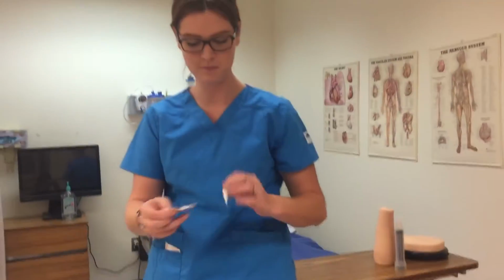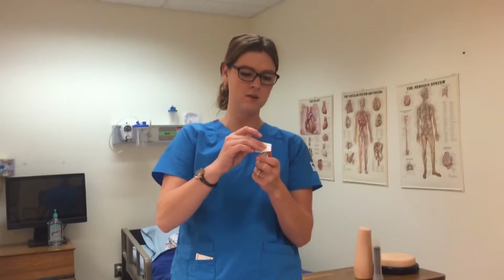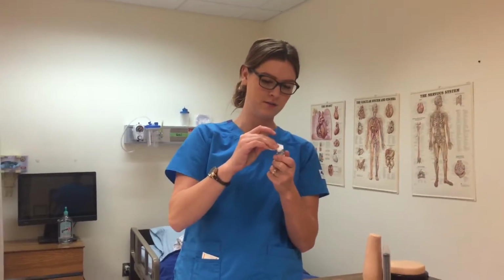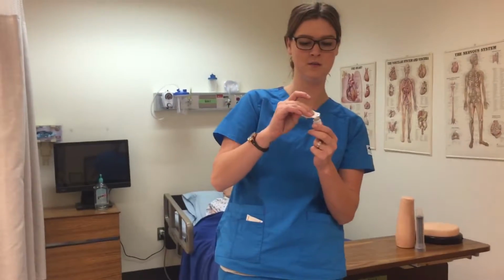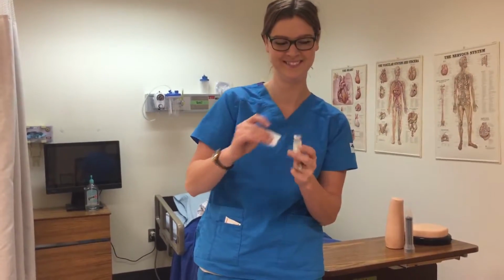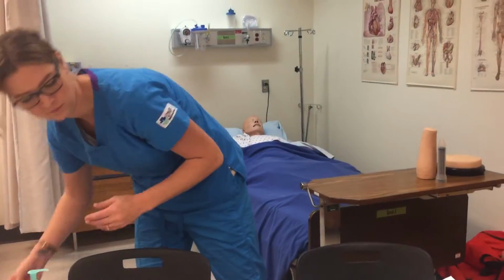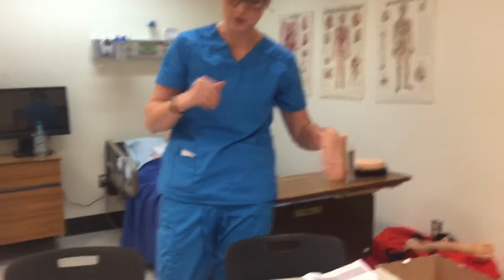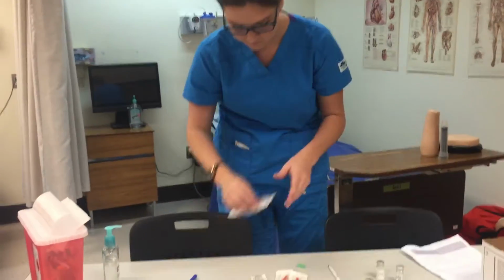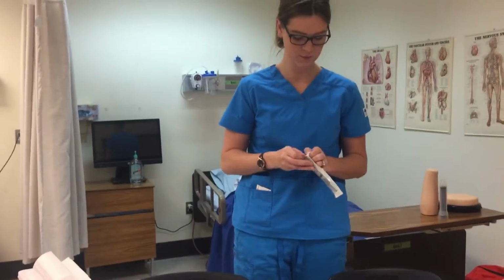I'm gonna clean the top because I wanna keep this procedure as clean as possible. So 10 to 15 seconds circular motion till it is completely dried. Okay, then I can toss these. Okay, so according to my MAR, it says 5 mils, but for this demo, we're gonna do 3. So, tops are clean.